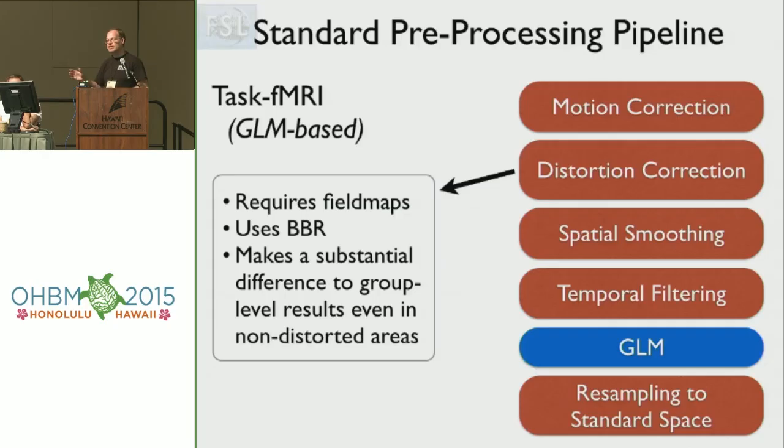The technique that we use to do the correction requires a field map, and that field map is either a separate sequence which you've measured. It might be a couple of different echo times worth of gradient echo data which you process, or increasingly we are getting it for free as part of our diffusion acquisitions. The recommendation we have for diffusion acquisitions these days is to have reversed phase-encoding directions, and from that, you can calculate a field map. So if you're getting diffusion data as well, then you might not have to have a separate acquisition for field maps, but get it for free.